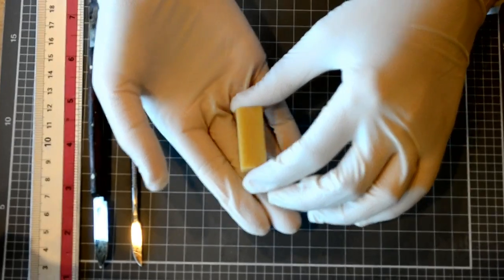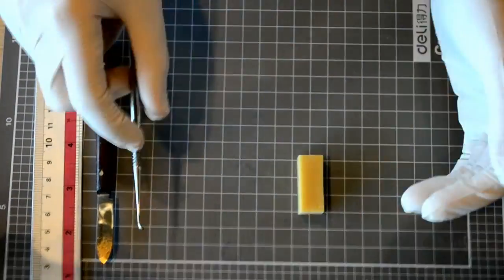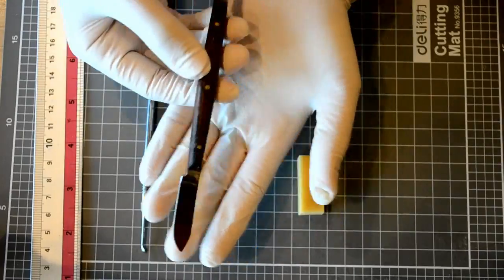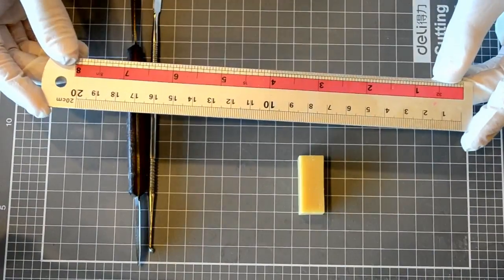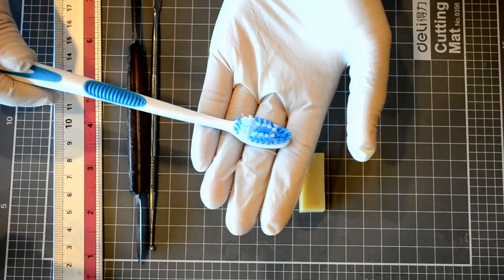What you'll need is a wax block, a Le Cron carver, a wax knife, a ruler, and optionally, a toothbrush to brush off the tooth after carving.